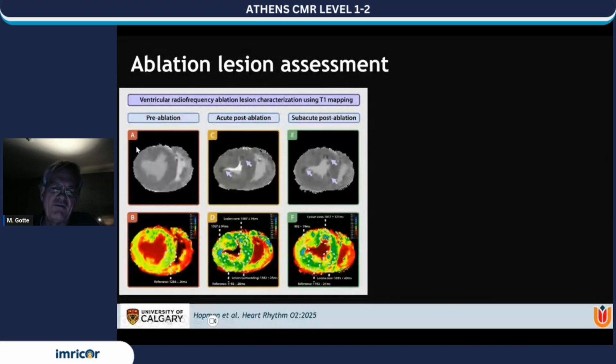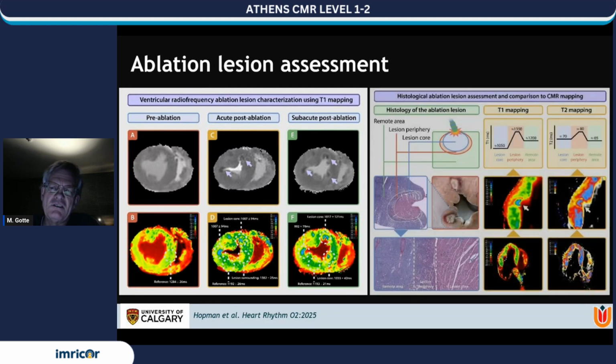And since we do have the heart, and we can apply histology, we can basically relate actual histology to the virtual histology provided by MR, and this helps us to interpret these images, to understand what we do locally at a tissue level if we ablate these hearts, and also learn more about what are the details we have to look for to interpret from a clinical perspective what lesions we have created, what are the consequences of these lesions, and how should we improve or can we improve the strategy to make sure that we create durable lesions over time.